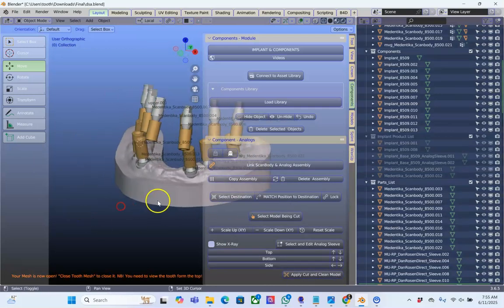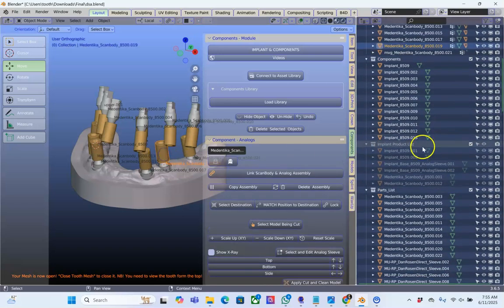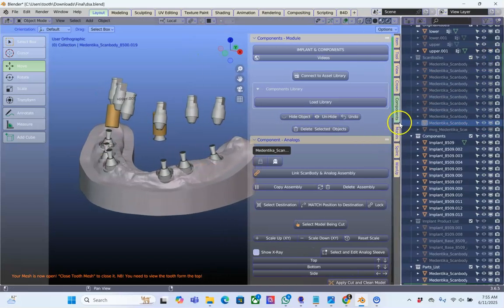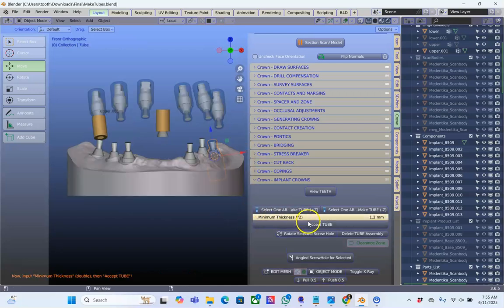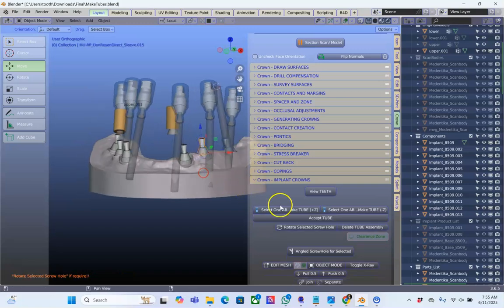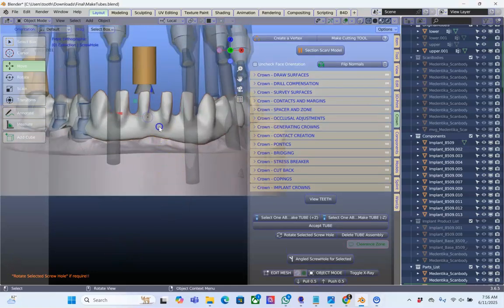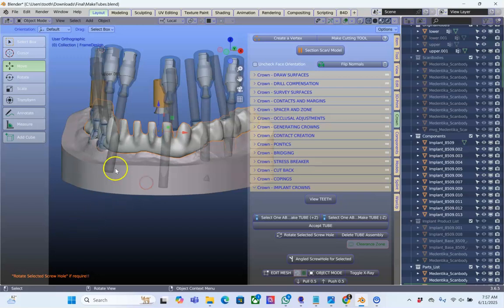Okay, finally, now we can hide the scan bodies. We don't need to see them anymore. So just select, look where they are, over here, hide them. Now go to the crown module, excellent, and go to the implants here, and we're going to make this tubing assembly. Okay, for each and every one of these with the holes, the screw holes. Okay, I've just paused this video just to speed things up again. Okay, so here we're going to accept this, and we're going to create our structure.